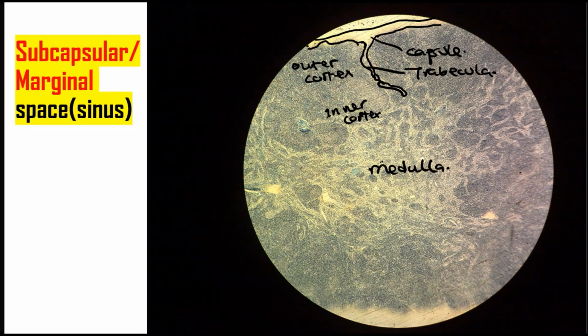This is the medulla. Now, as you can see, the outer cortex has got lymphatic nodules. They're not very prominent here, but they're there. So the lymphatic nodules are these nodules here. They're simply aggregates of lymphocytes.